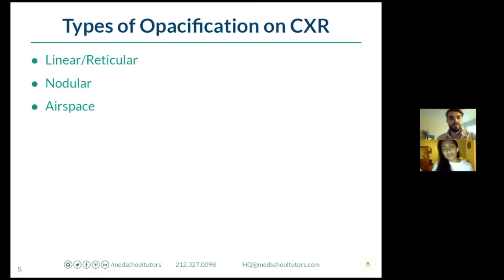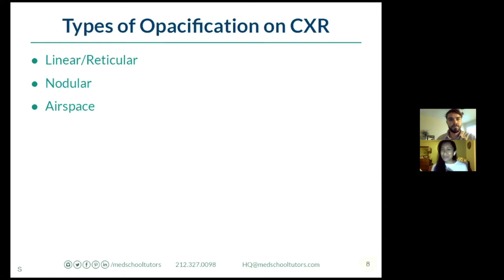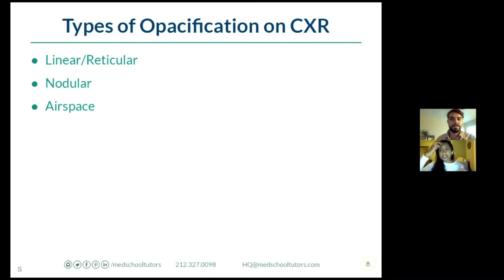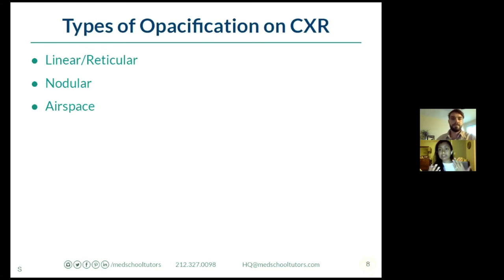Now let's talk about abnormal findings on chest x-ray and the radiology terminology - what those patterns mean in terms of imaging. Types of opacification: on chest x-ray, all you're really looking for is whether there's something white that should not be there, because the lungs should be completely black. Is there more white than expected? Is the white a linear, branching pattern - a reticular pattern? That suggests something like straws or branches of a tree.